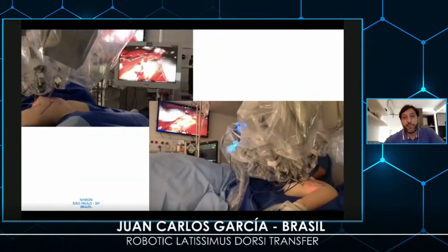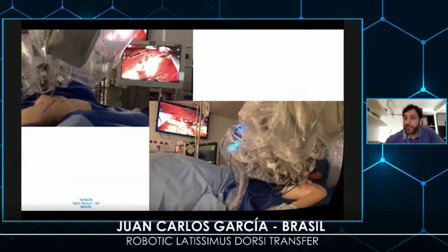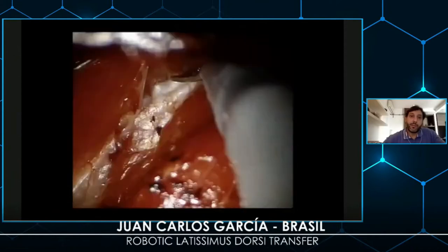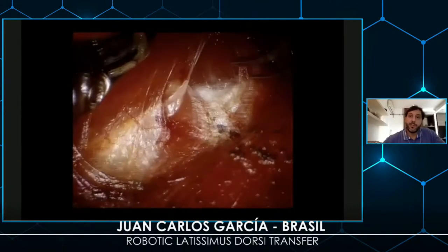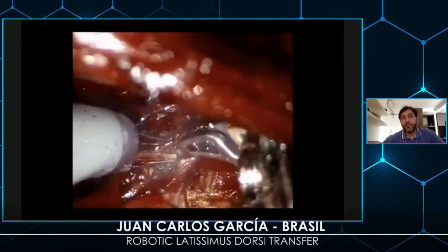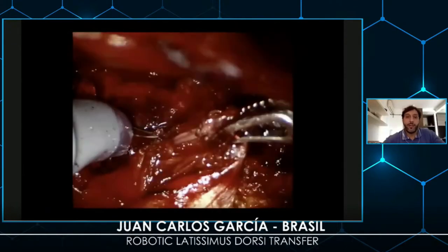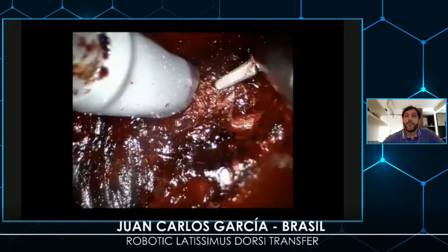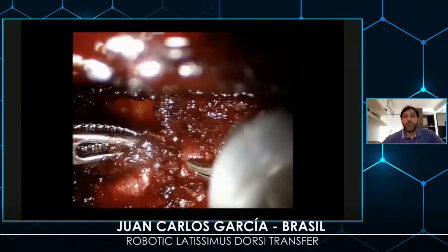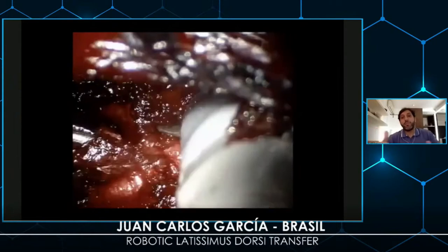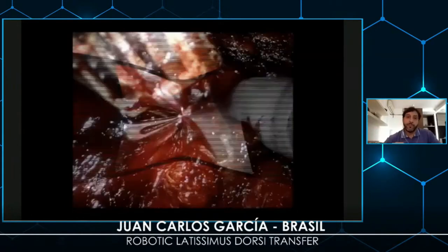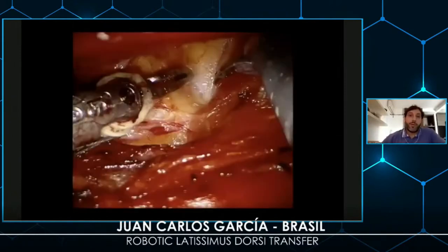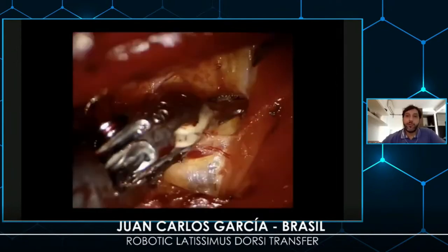Here is how we make the surgery, with an external view of the surgery and how it looks internally. The teres major is separated from the latissimus dorsi. In this image you can see we are cutting the latissimus dorsi very near its insertion. Cutting more, you can see the radial nerve just below the latissimus dorsi. We then start to manage the latissimus dorsi to separate it from the teres major — here you can see better the latissimus.